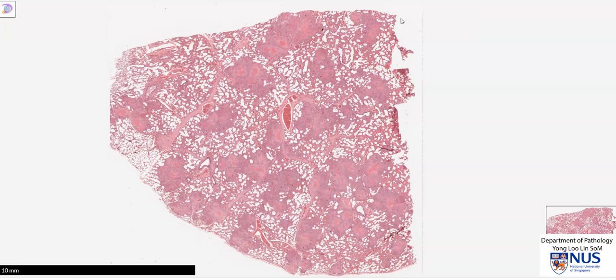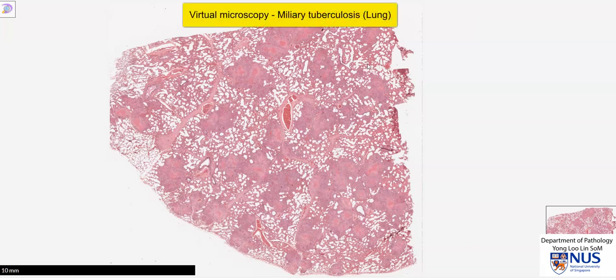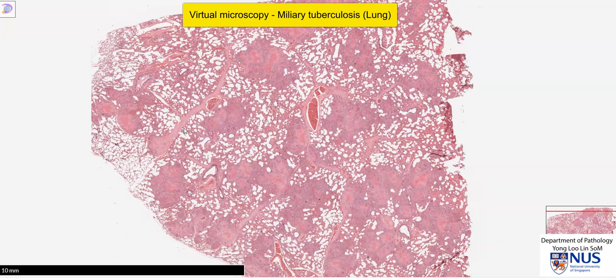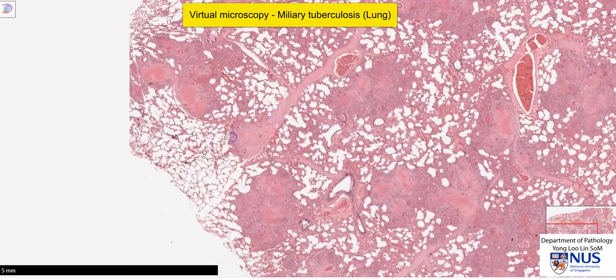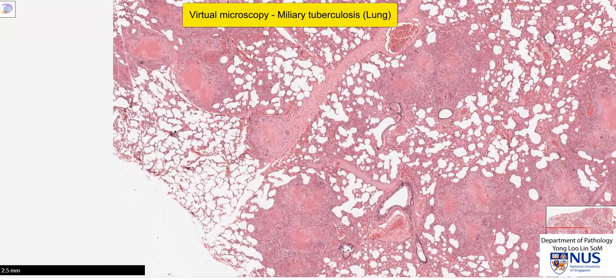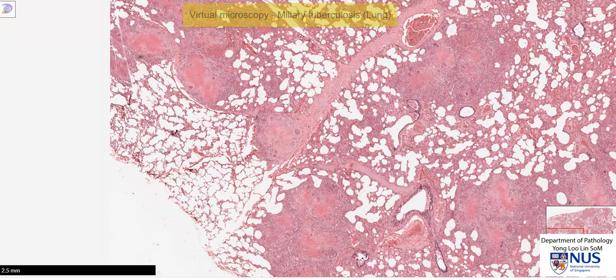This is a virtual microscopy slide of a lung, taken from a case of miliary tuberculosis. Let's first appreciate the normal lung parenchyma, which is composed of these very spongy appearing alveolar spaces that essentially just contain air, so it looks quite spongy and quite empty.